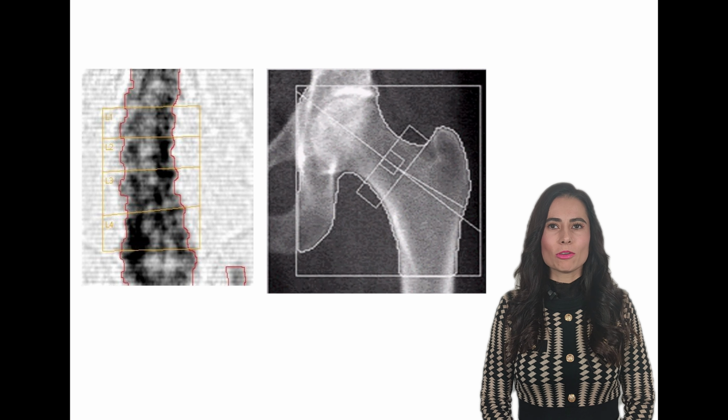Accuracy is when, for example, you shoot at a target and hit it right on. This means you were accurate. The same applies to osteodensitometry. The device is accurate if the diagnosis of osteoporosis, osteopenia, or normal bone density is correctly determined.